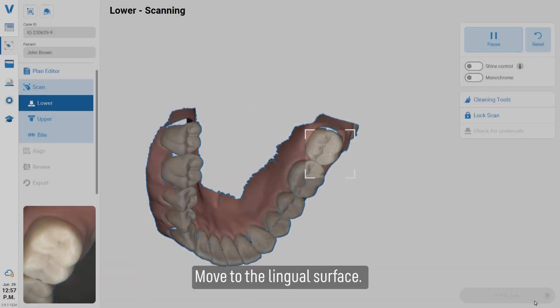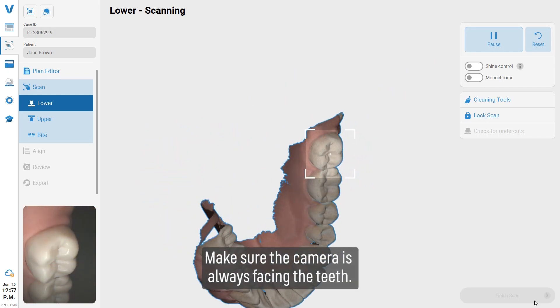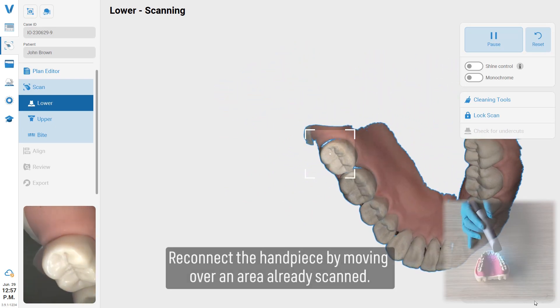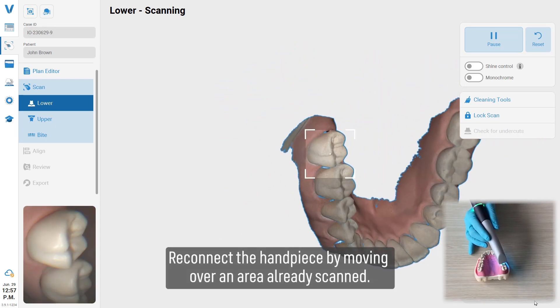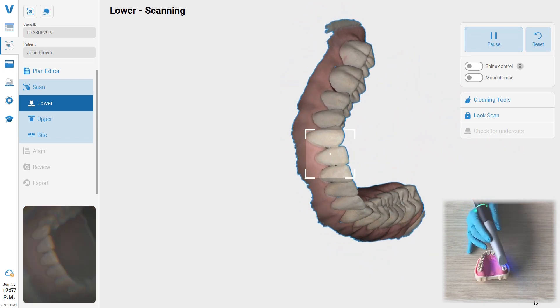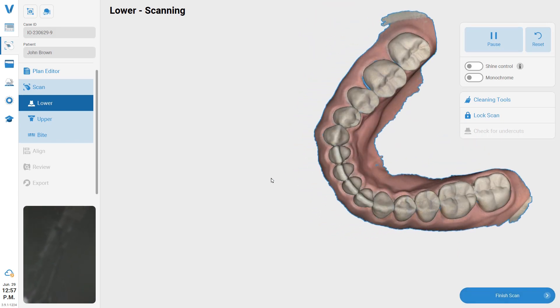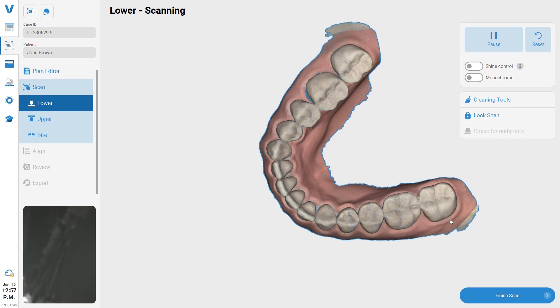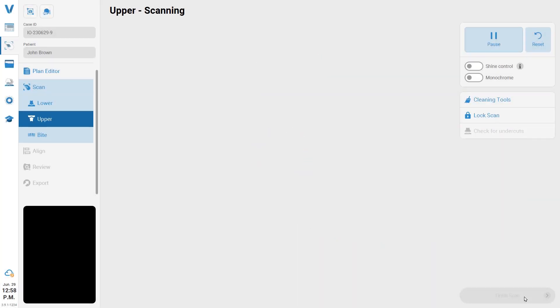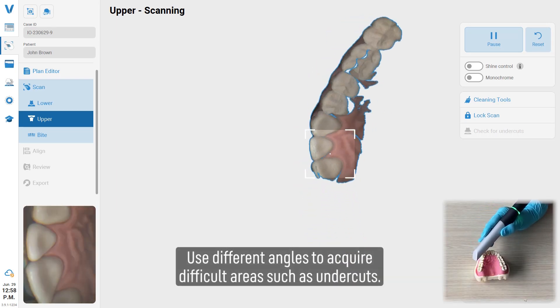Move to the lingual surface. Make sure the camera is always facing the teeth. Reconnect the handpiece by moving slowly over an area already scanned. Use different angles to acquire difficult areas such as undercuts.